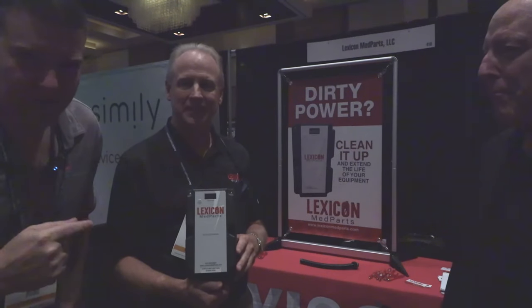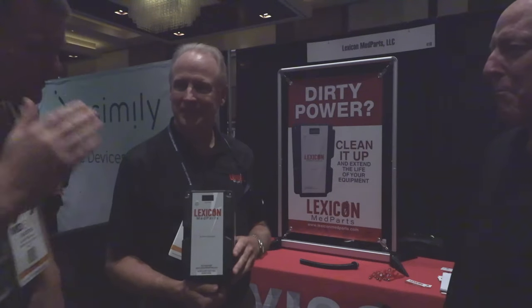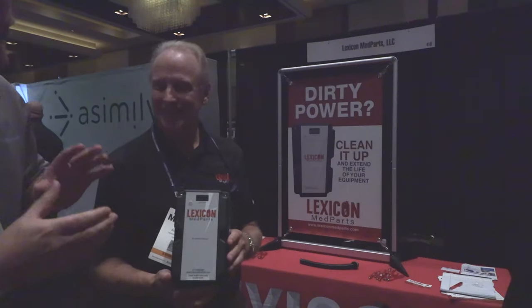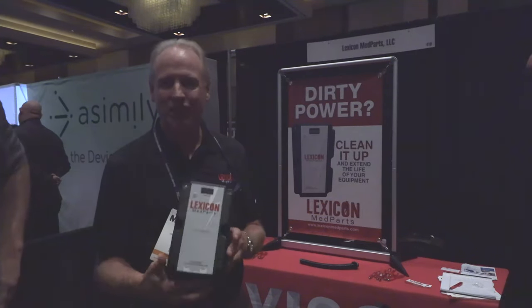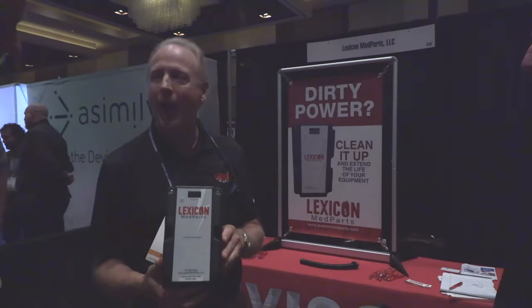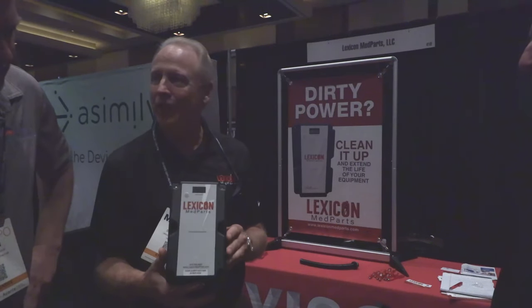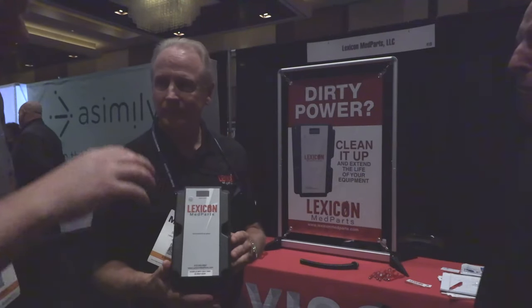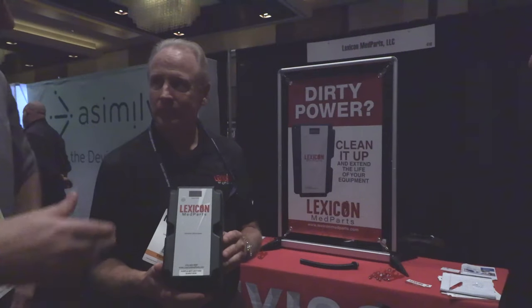Maybe a product like this can help solve those problems for you. So this is a passive power filter — it's called Lexicon Med Parts. We have a medical power filter that's cleaning up dirty power, and it's for any imaging equipment in any hospital or any facility.